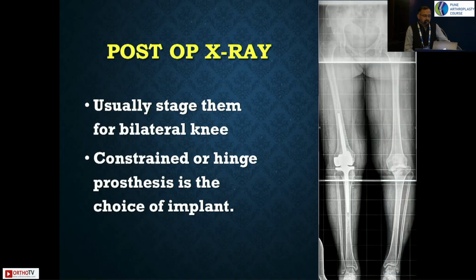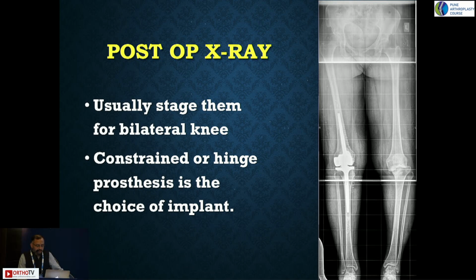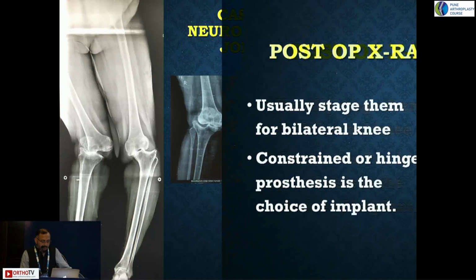So usually these knees are done in a staged manner. Don't do it bilateral in one go. One unilateral at a time always works well, or a staggered TKR.